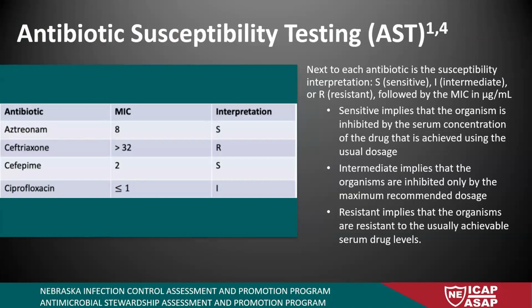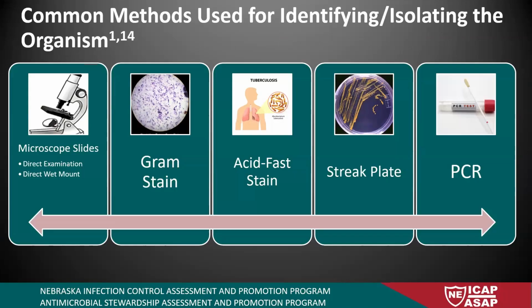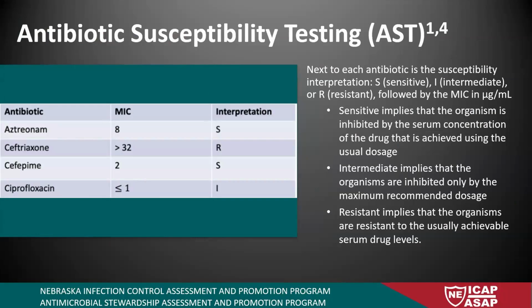And here's some vaginal fungal cultures. Again, or yeast infection. There's a whole bunch of different kinds here, but this is an ESBL report. You always want to look where it says positive in really big letters. That means it's something you want to look for. Positive for an ESBL, like, okay, I got it. I understood what you're trying to say there.